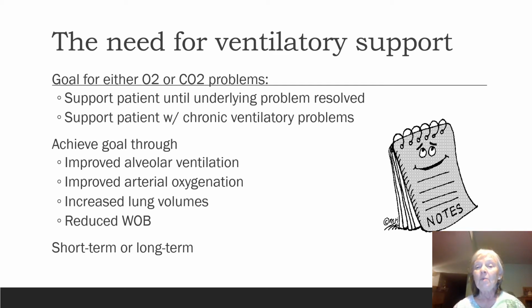We had a gentleman one time, we came into work, they said, you guys need to go down to the ED. There's a patient who suffered anaphylaxis, and they went into status, okay? So we go down there, we do the ABG, the patient's pH was 7.06, and we were suctioning out some shrimp and potatoes and other things out of his airway.